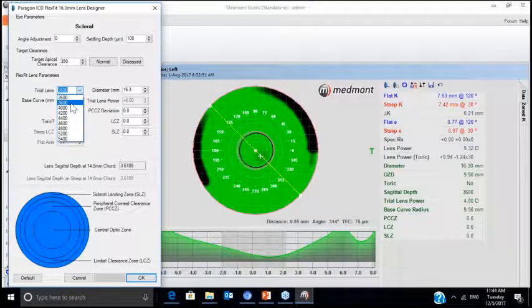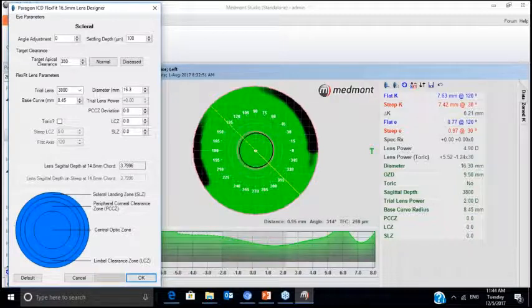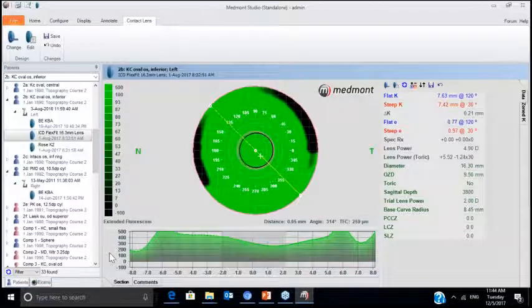And it's becoming apparent that we are getting relatively close to the cone with this much lower sagittal depth lens. We're at 76 microns of fluid. A healthy scleral fit should be at least 100 microns over the central corneal tissue.